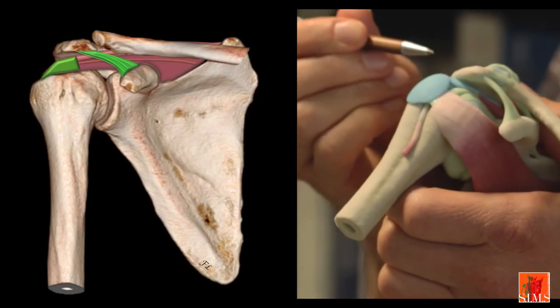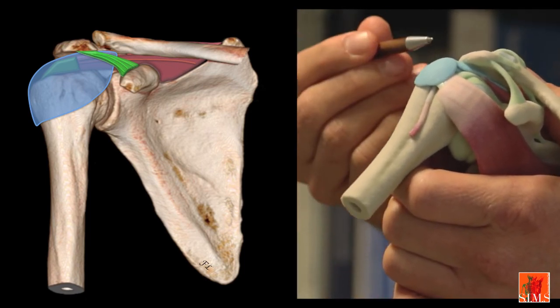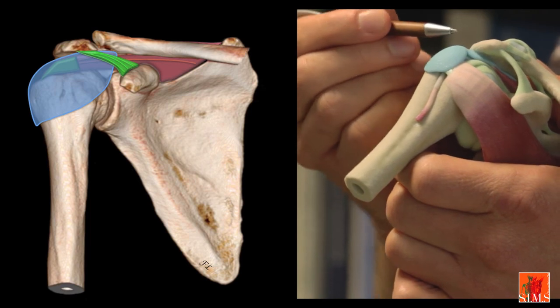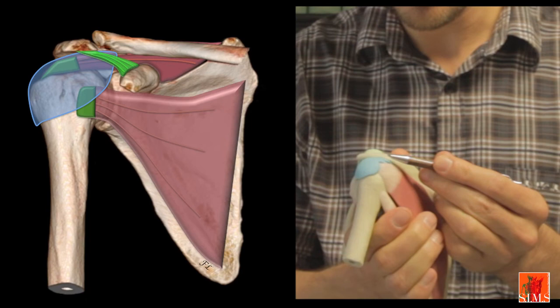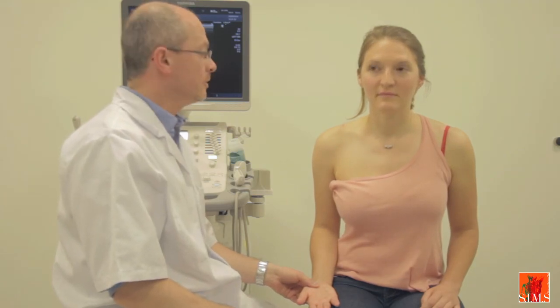Opposite the tendons of the rotator cuff, there is a serous bursa known as the subacromial subdeltoid bursa, which is shown here in blue. It penetrates inwards, under the acromion, and runs outwards along the humerus, but also forwards superficial to the subscapularis and backwards superficial to the infraspinatus. We will now go on to study the anterosuperior region and its main tendon, that is, the supraspinatus.